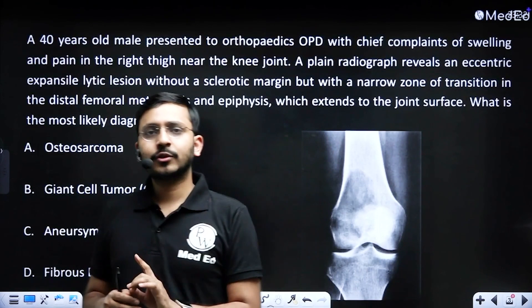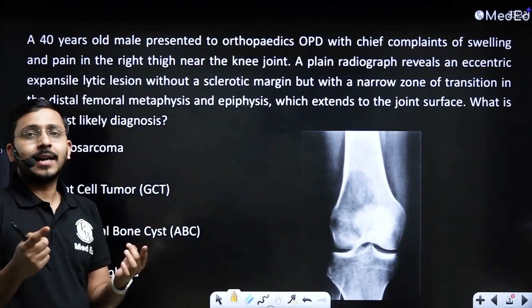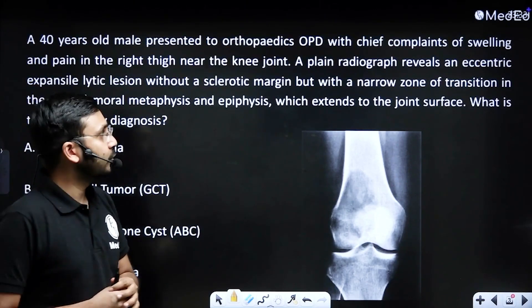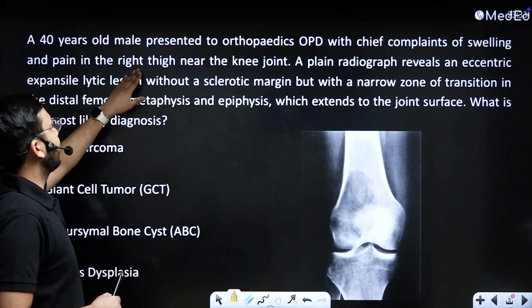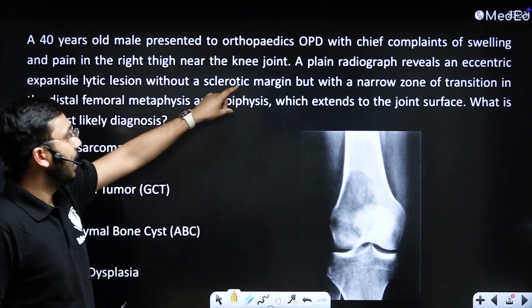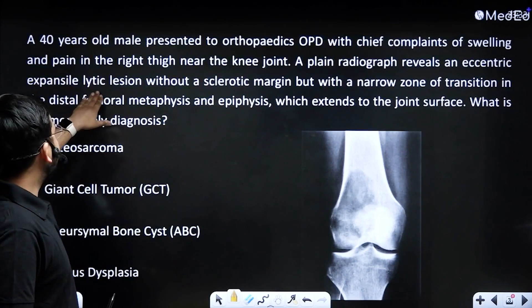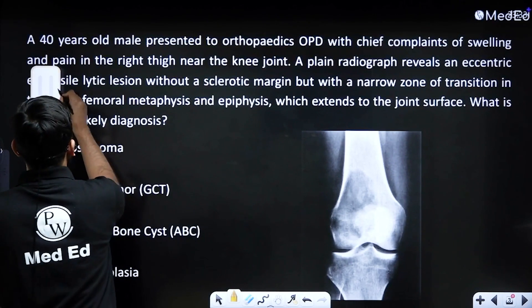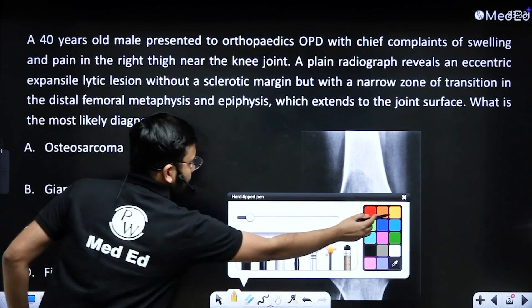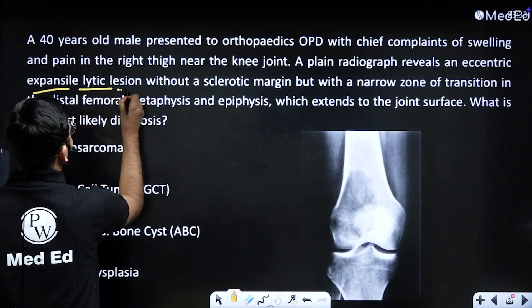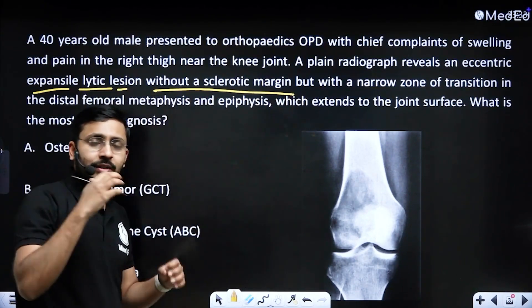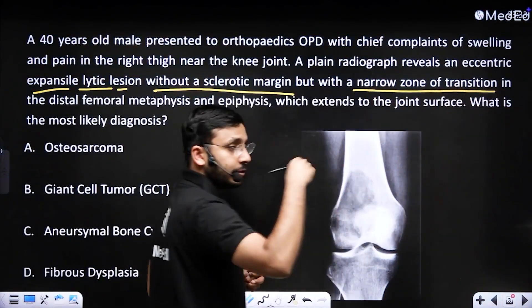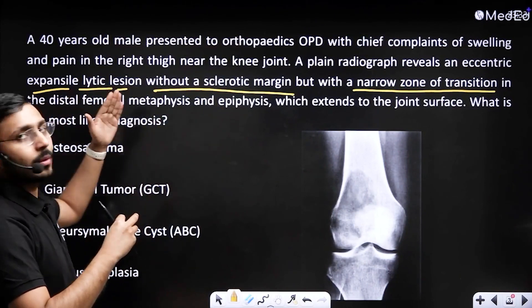A quick question: a 40-year-old male presented to the orthopedics OPD with chief complaints of swelling and pain in the right thigh near the knee joint. A plain radiograph reveals an eccentric expansile lytic lesion without a sclerotic margin. We'll discuss what is the importance of all these terms today — expansile lytic lesion without a sclerotic margin, with a narrow zone of transition. These are important buzzwords that point to a particular diagnosis.